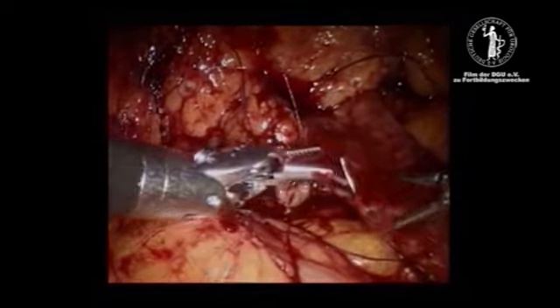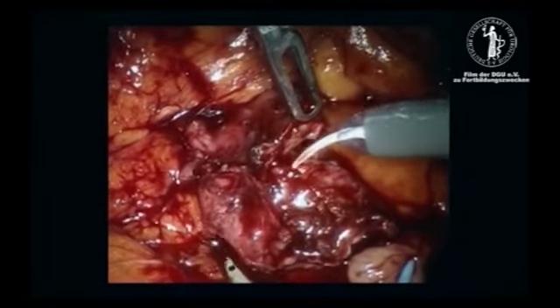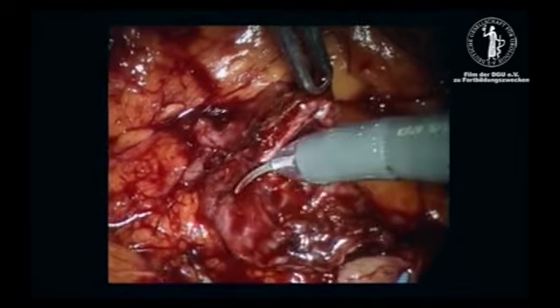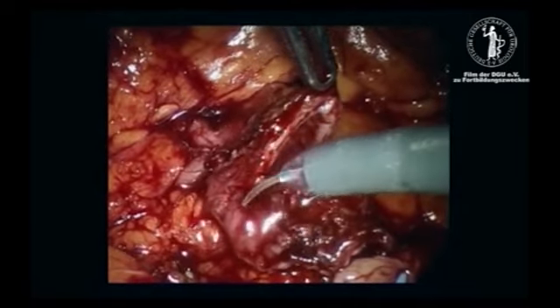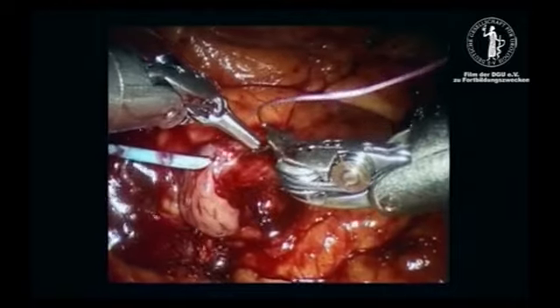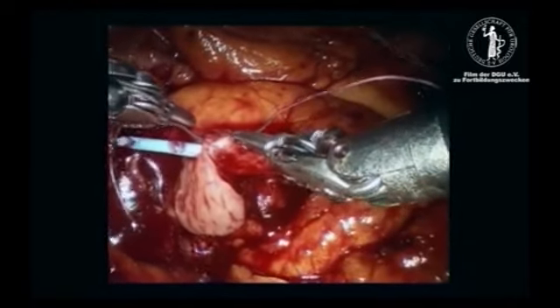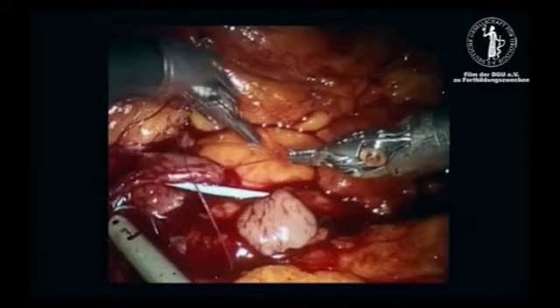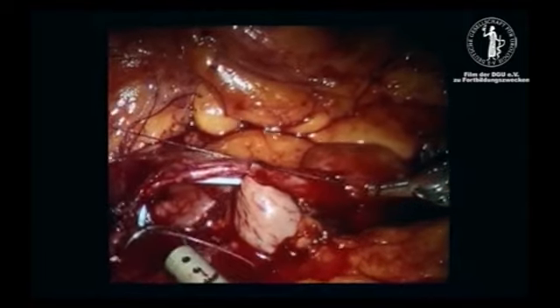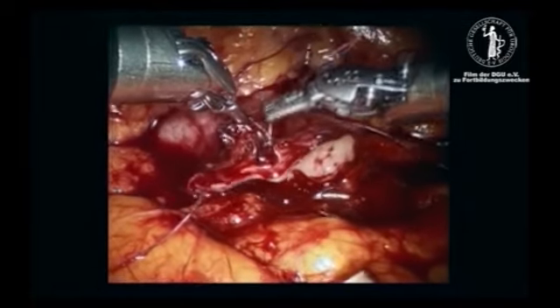The enlarged lower pole renal pelvis is reduced in size. With the use of anchor stitches, the semi-circular retropelvic anastomosis is sewn and the redimensioned renal pelvis closed.